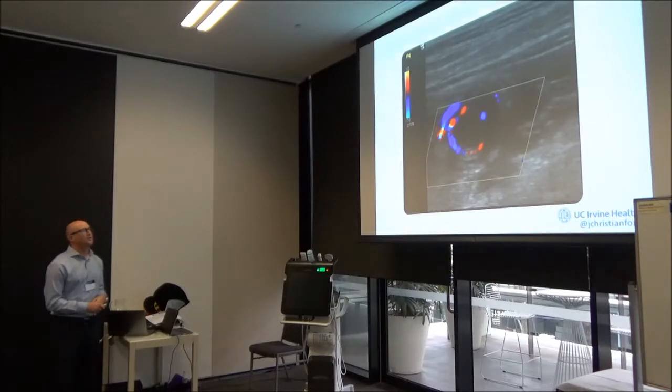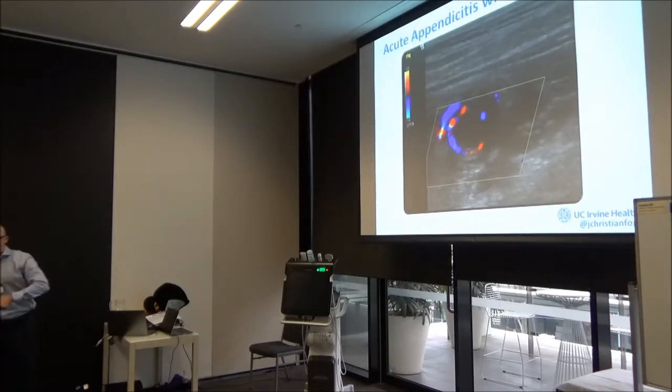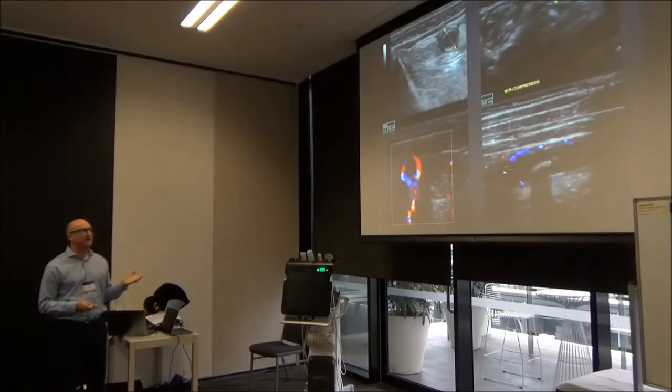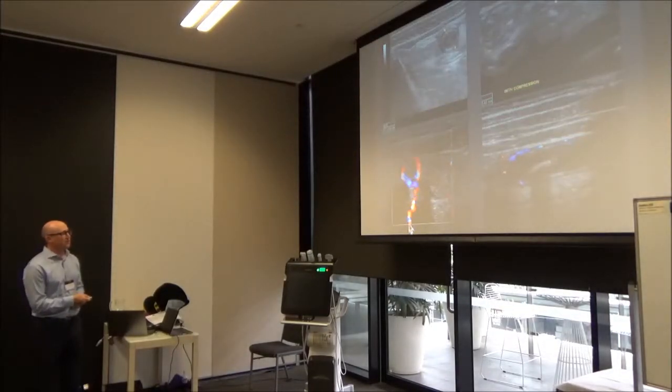I don't know how prognostic it is for having a more complicated appendicitis or not, but it's pretty to see. You see these rings of fire. You can actually see this one with the vascular stalk going to it. Next door, I like the terminal ileum here. I like the TI over here as well, adjacent to our appendix on this one up here.